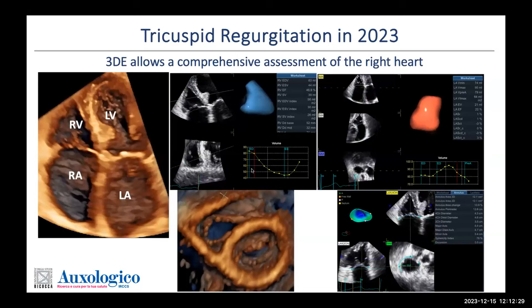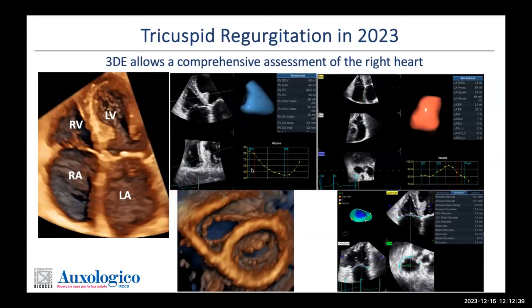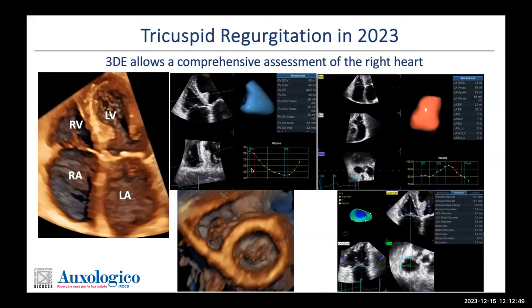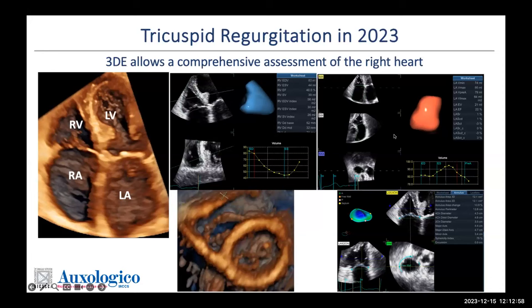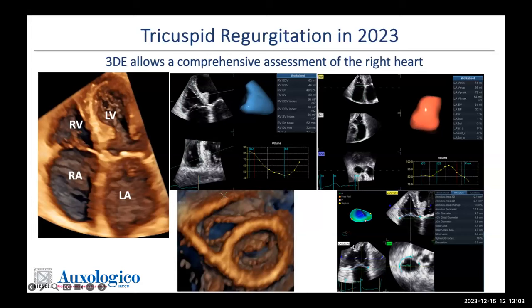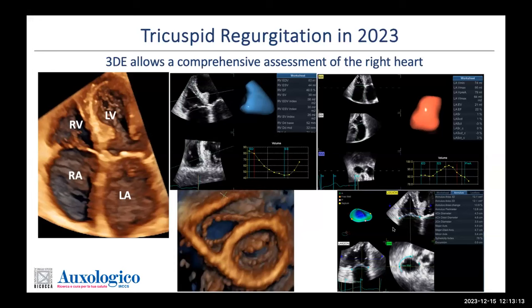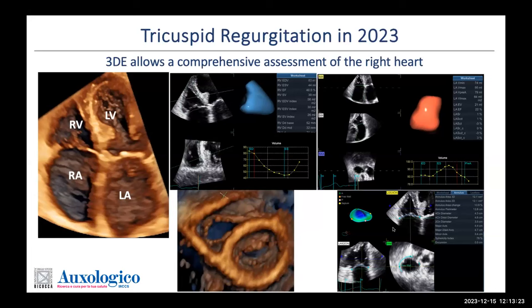Three-dimensional echocardiography is not just for looking at valve morphology. For the first time, it gave us the opportunity to quantify volumes and ejection fraction of the right ventricle without any geometrical assumption on this complex chamber. We can also assess the right atrium and quantify the size and shape of the tricuspid annulus — being able to assess all components of what I would call the tricuspid valve apparatus. This has led to great advancement in understanding the pathophysiology of tricuspid regurgitation.